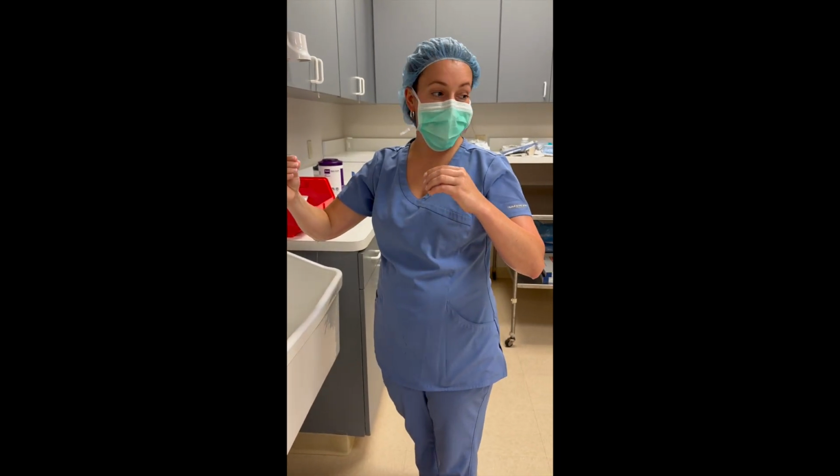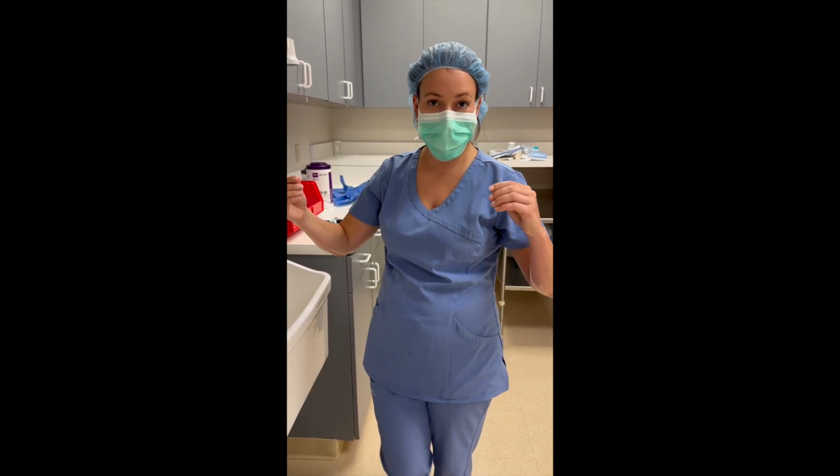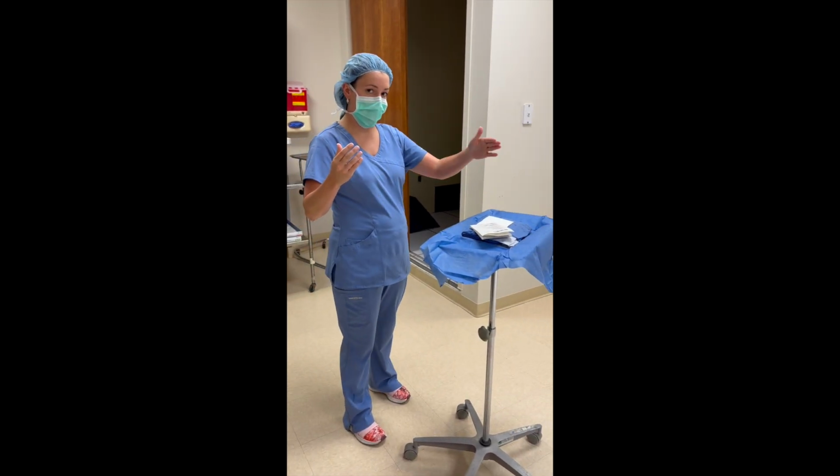All right. And now I'm going to proceed to dry my hands appropriately and put on my sterile PPE. Okay, I just finished surgically prepping my hands for my surgical procedure. I'm going to come in. This is still my sterile field right here, right?